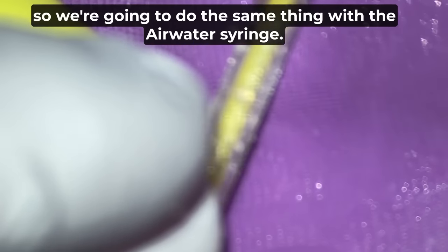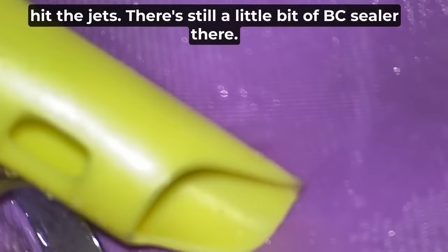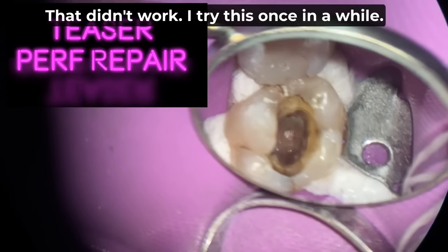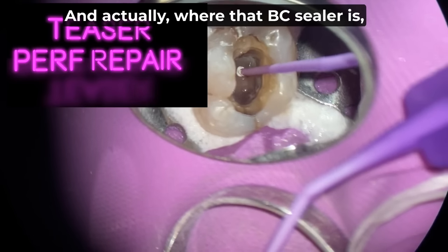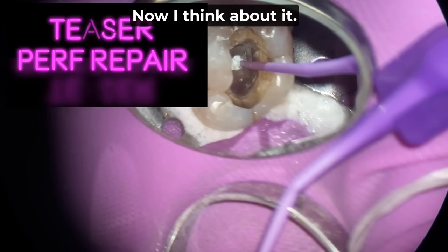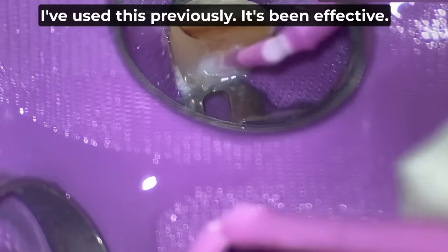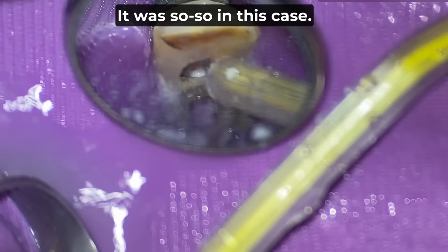All right, so we're going to do the same thing with the air water syringe. We're just going to hit both buttons, hit the jets. There's still a little bit of BC sealer there. So what I did was, I was like, let's try using a microbrush. That didn't work. I try different things once in a while. Actually, the BC sealer is where that perforation towards the lingual is. So we're going to use a little scrub brush, scrub that out. I've used this previously and it's been effective. We scrubbed that BC sealer out of there. It was so-so in this case.